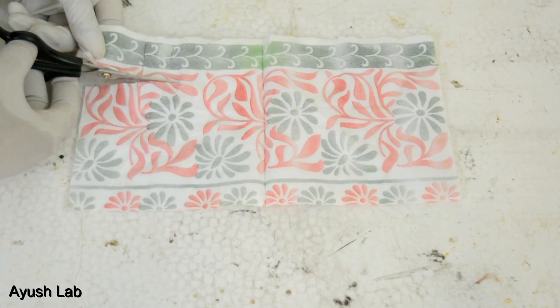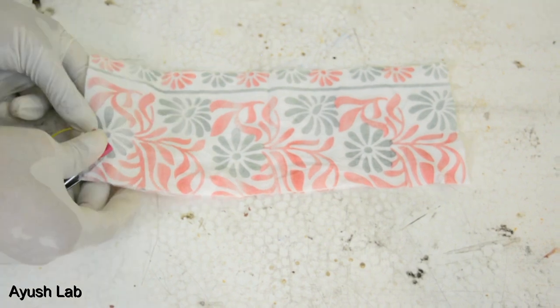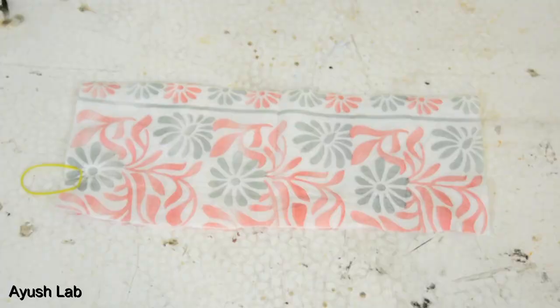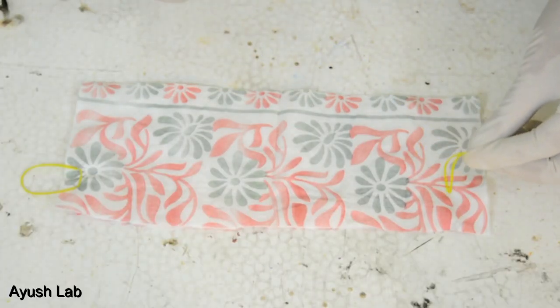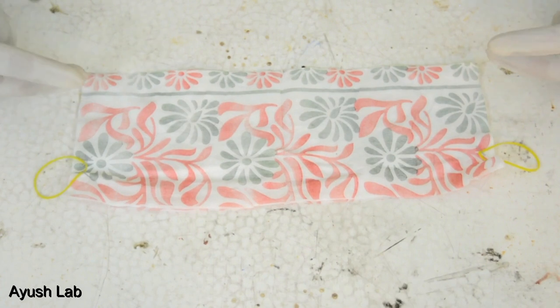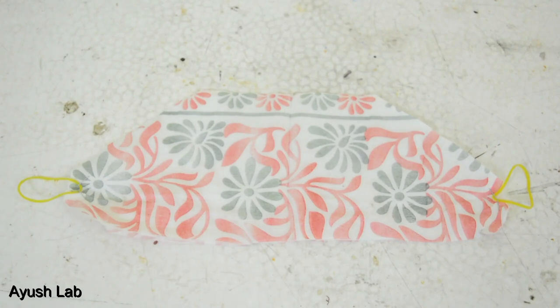First, we will cut the tissue paper. Now we will attach the rubber bands — something like this — and we will attach this rubber band on the other side. So the two sides' rubber bands are put. And we will cut the extra part. So here our mask is now.